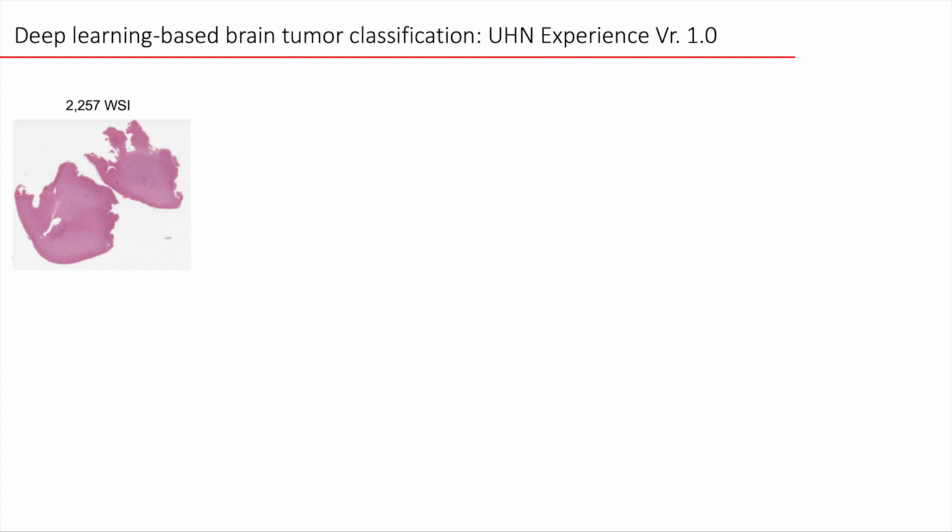So we're constantly doing this, as this is kind of the major goal of computer vision in computational pathology at the moment. And this is one of our first large-scale experiences with this approach. We collected 2,257 slides spanning 400 cases. Just to give you a context, that's about 0.75 of a full-time equivalent of one of our neuropathologists. So quite a significant number of cases.